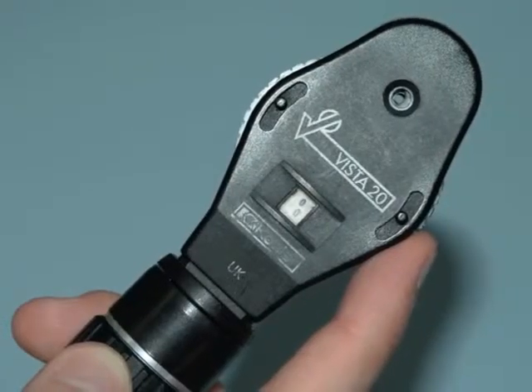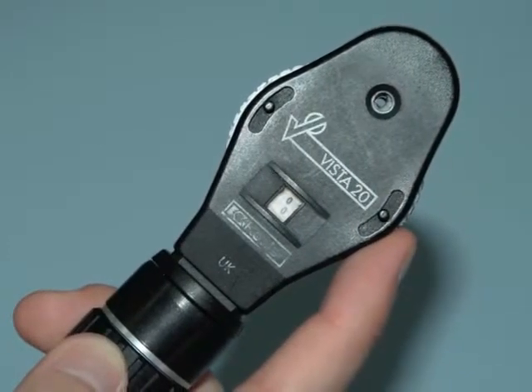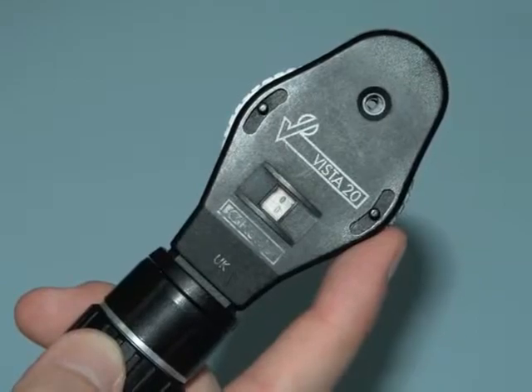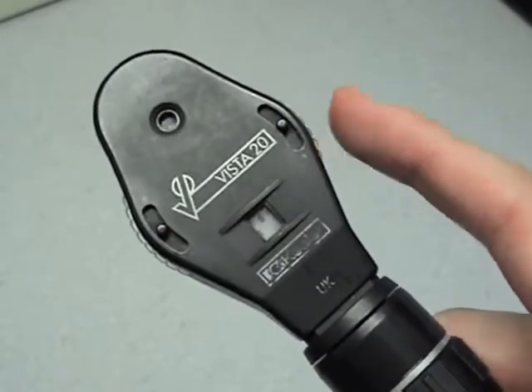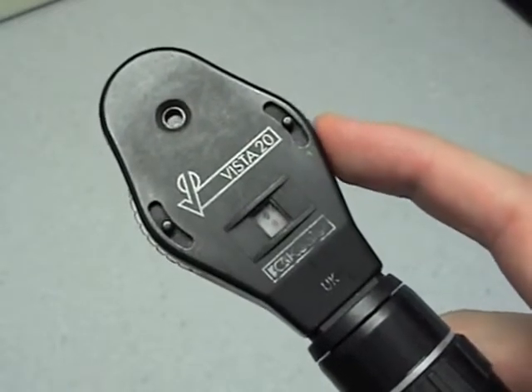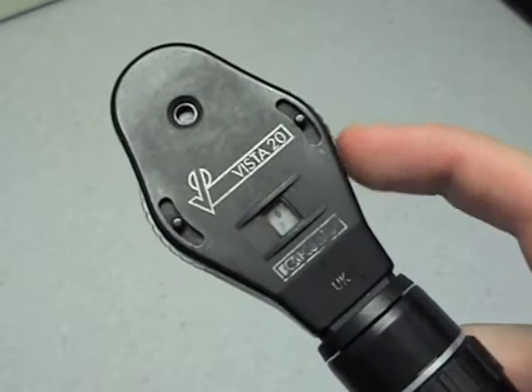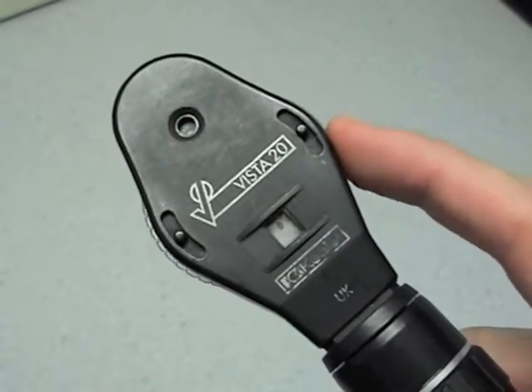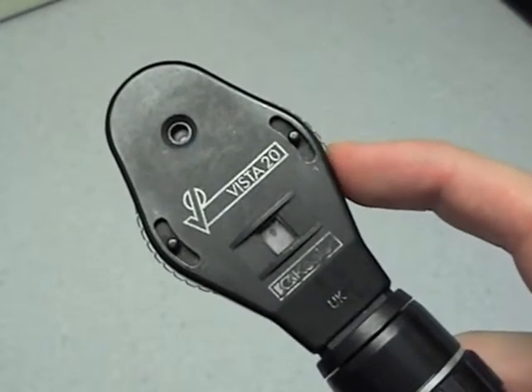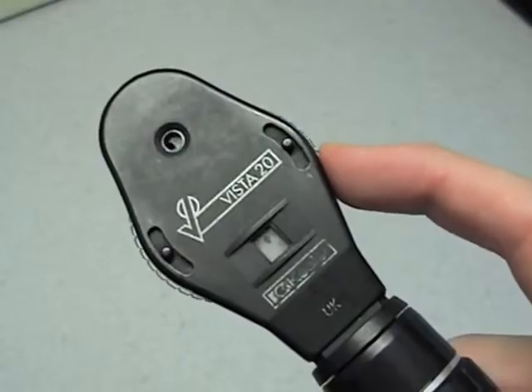The dials on the side of the head select the strength of the lens being used to view the fundus. Plus lenses are usually green, yellow or black and are dialed clockwise, with minus lenses most often being red and dialed anti-clockwise. This is used to bring the various structures into focus whilst examining the eye, and also compensates for the refractive error in both the patient and the examiner. For example, if the observer has no refractive error but the patient is myopic or short-sighted, then minus lenses would be required to bring the fundus into focus.